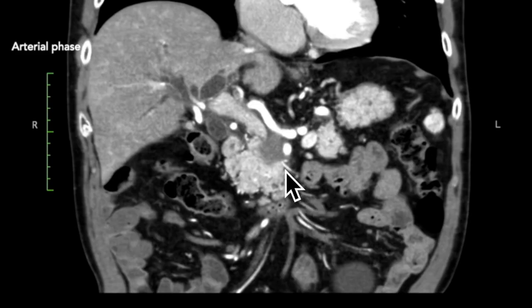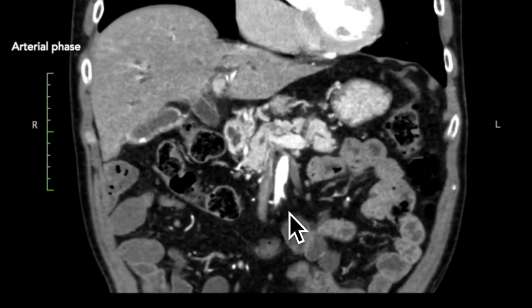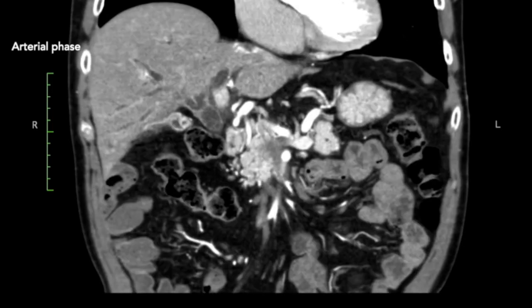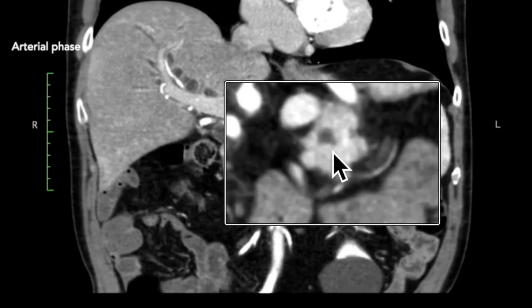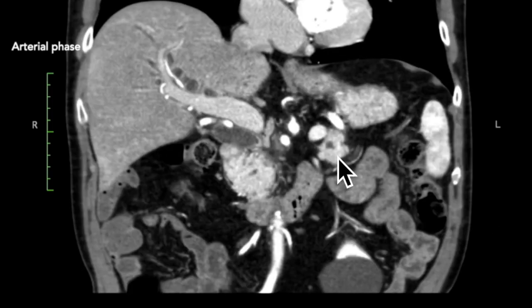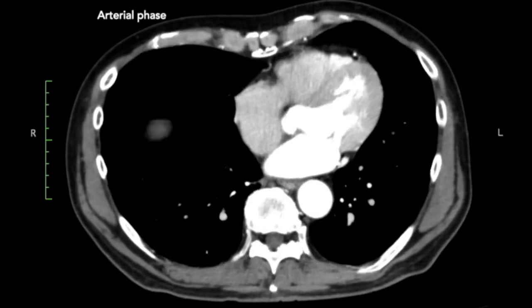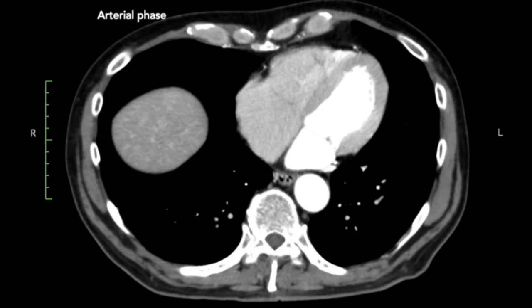So again, solid, hypovascular, consistent with a pancreatic adenocarcinoma. Looking at the rest of the pancreas, apart from a small cystic lesion here — probably a side-branch IPMN — the parenchyma is normal. So the next step would be staging the tumor.